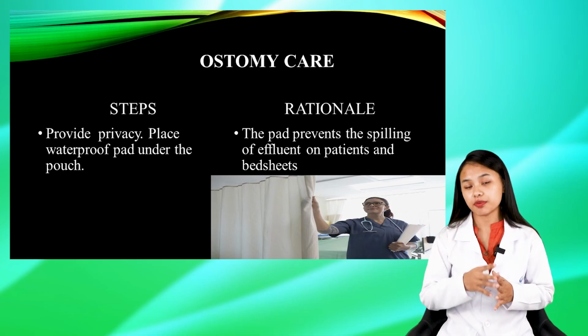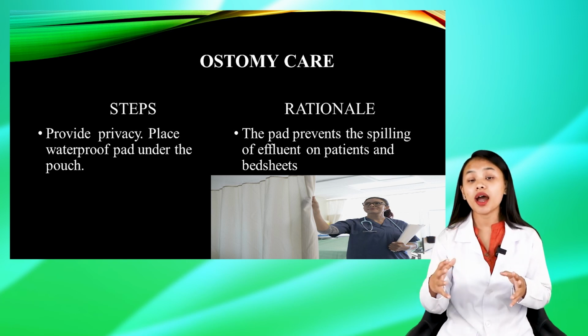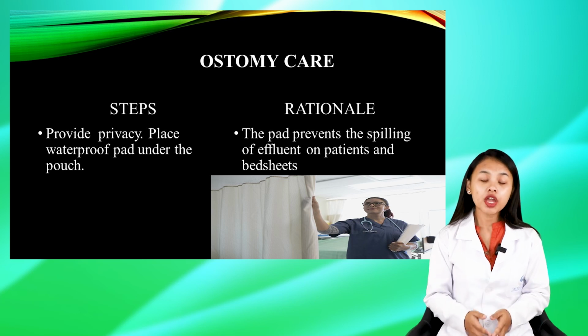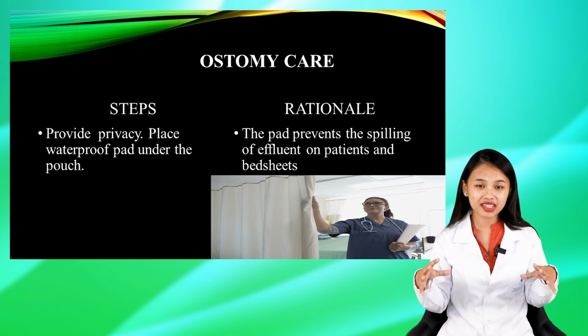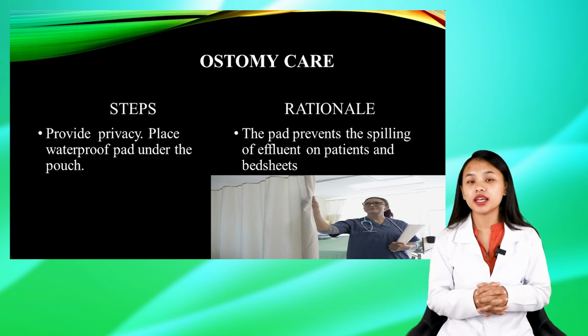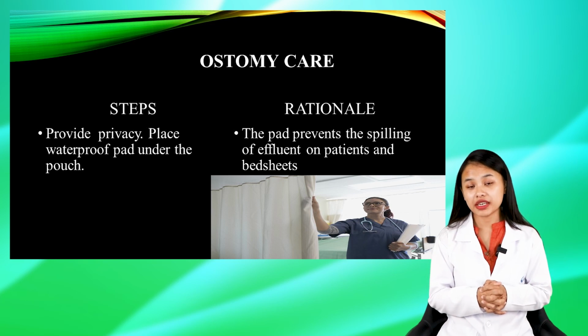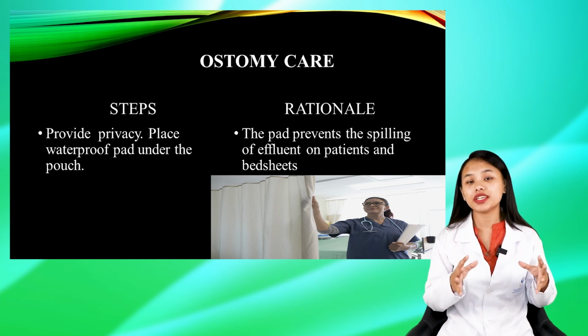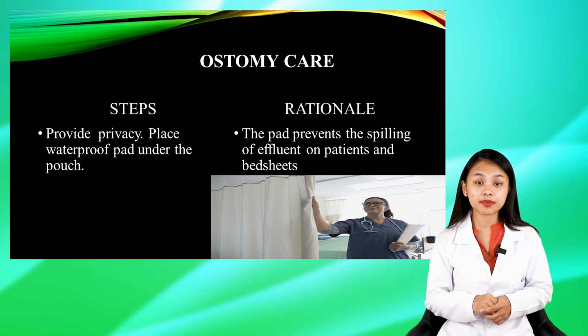You must provide privacy to the patient in order to enhance their comfort level. Then you must place a waterproof pad under the pouch. By placing a waterproof pad, it would help to prevent the spilling of the effluent on the patient as well as the bed sheet.